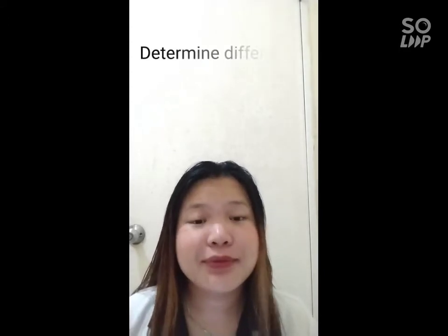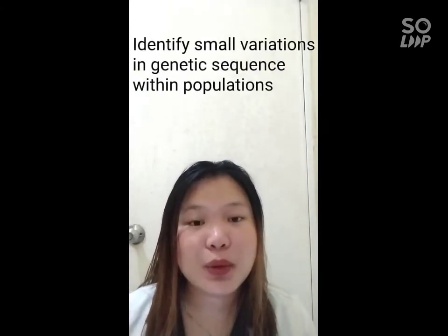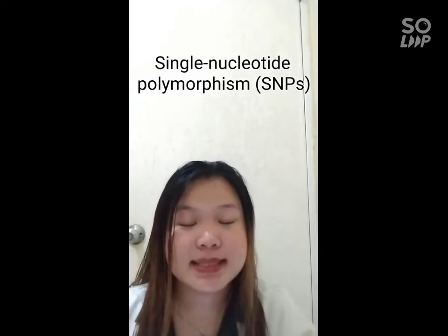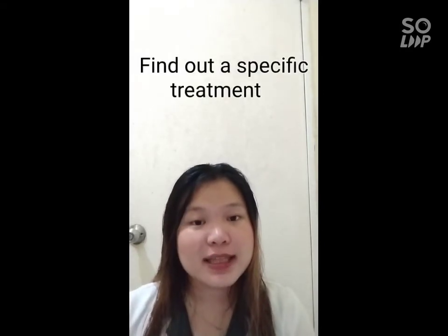Genotyping determines differences in a genetic complement by comparing a DNA sequence to that of another sample or a reference sequence. It identifies small variations in genetic sequence within populations, such as single nucleotide polymorphisms, or SNPs. Genotype determination can also be used for the identification of susceptibility and prognosis for any disease and to find out for a specific treatment, thus leading the way towards personalized medicine.